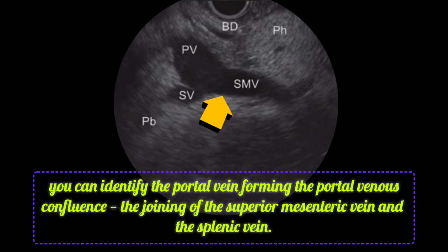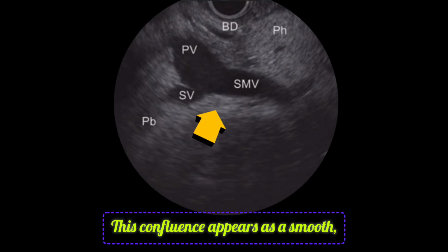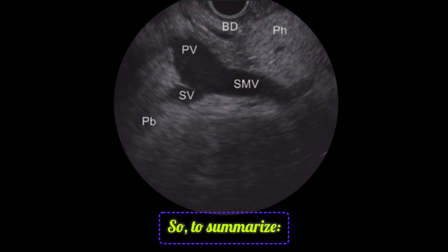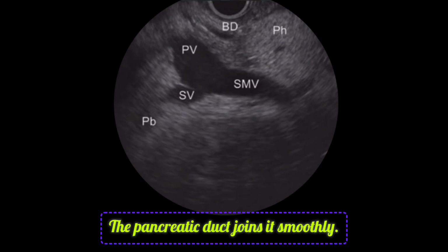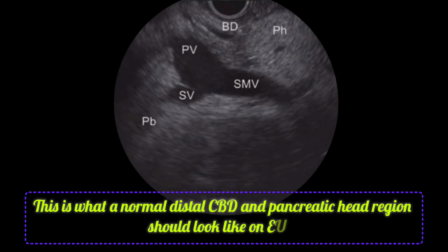You can identify the portal vein forming the portal venous confluence, the joining of the superior mesenteric vein and the splenic vein. This confluence appears as a smooth, rounded anechoic channel, a reliable landmark in EUS orientation. So to summarize, the CBD is tubular and anechoic. The pancreatic duct joins it smoothly. The portal confluence lies just behind, well-defined and regular. This is what a normal distal CBD and pancreatic head region should look like on EUS.